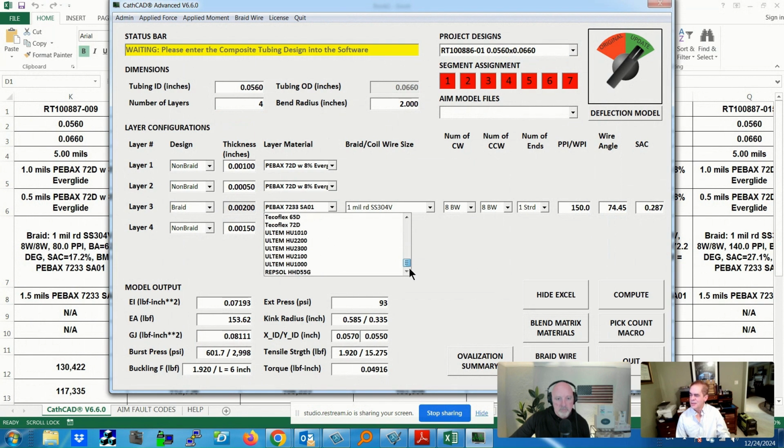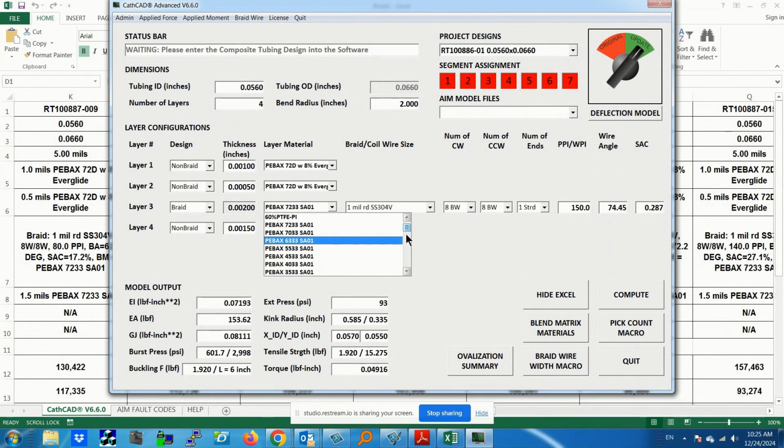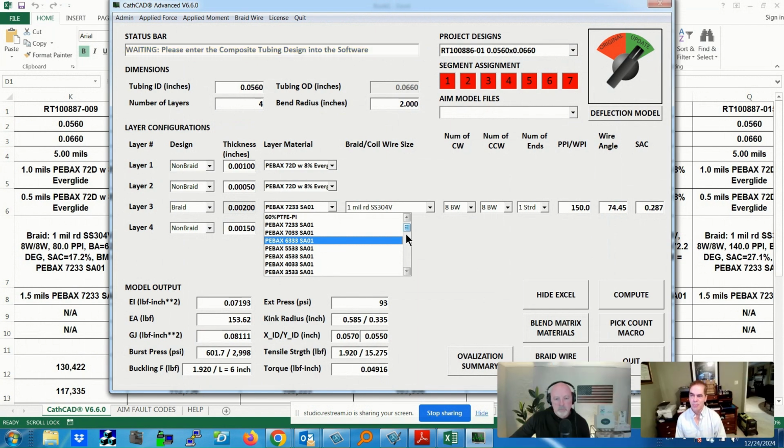And again, a lot of these values come from the manufacturer's data sheets. We're actually looking at generating our own because we believe in some cases that the materials provided by the manufacturer are not as precise as what we need in the medical device industry. So we've seen some cases where we think that the properties could be made better. And in some cases we've done that. But again, the model output depends on the material property data being proper. So that's one thing we're looking at here in the future to make things better.